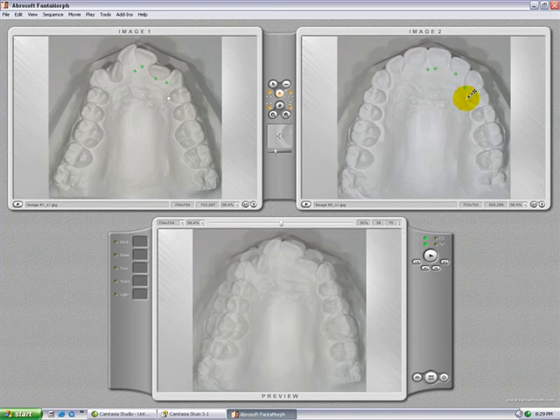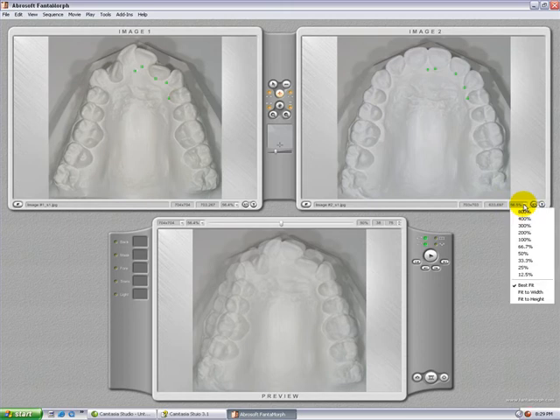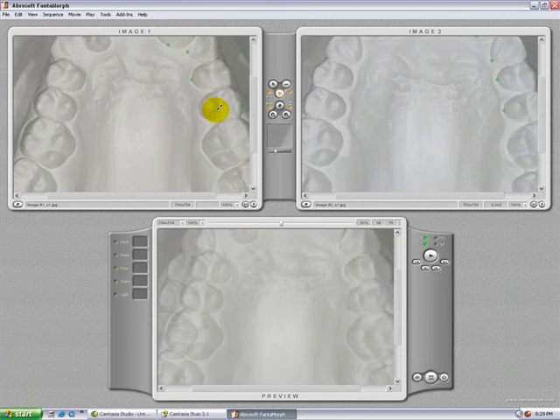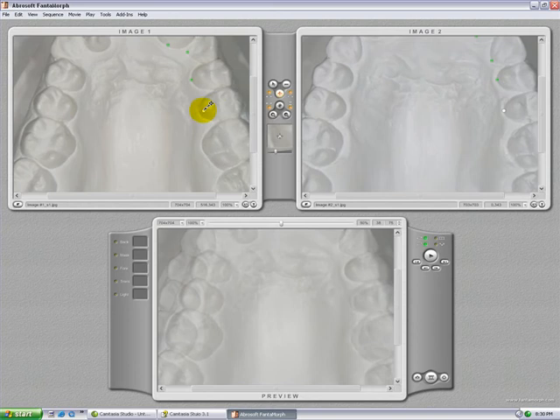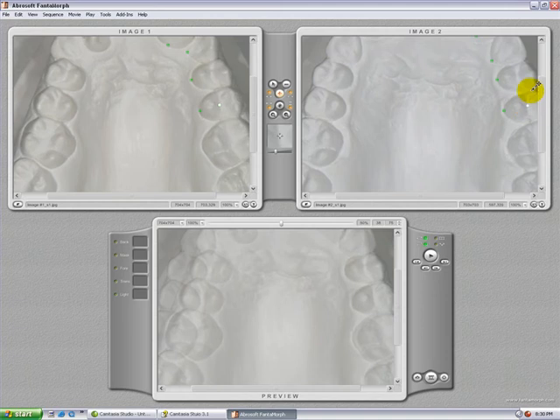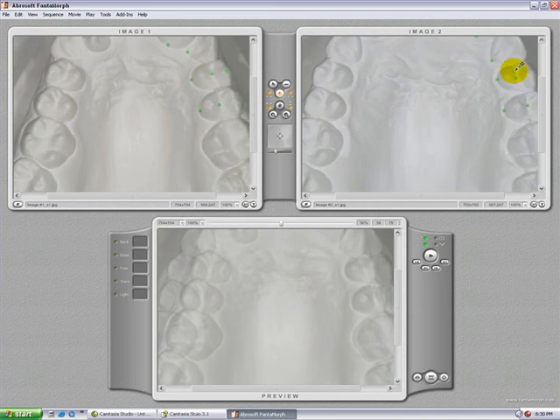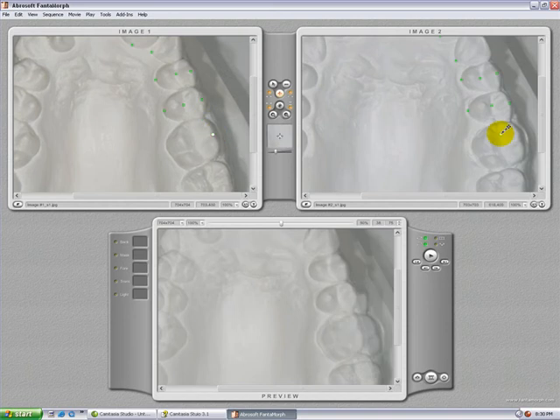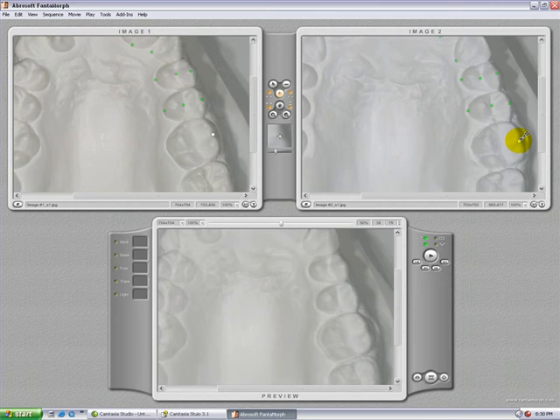To make a more exact indication of the location of your landmarks, you can magnify the area. Try to indicate your landmarks as precisely as possible — this will guarantee a very smooth result. Good landmarks for these are cusp, fossa, and gingival margins.